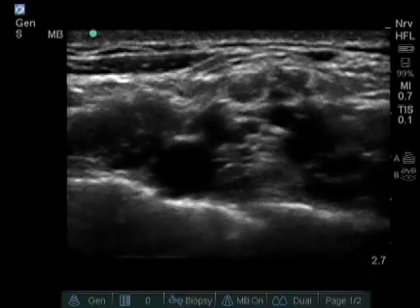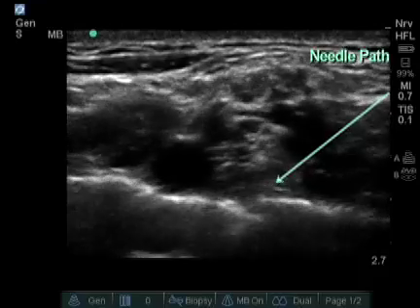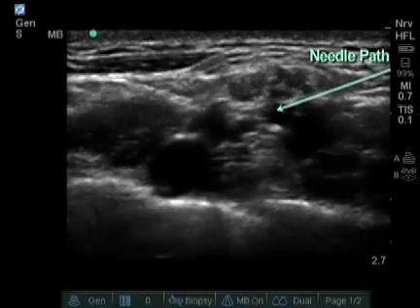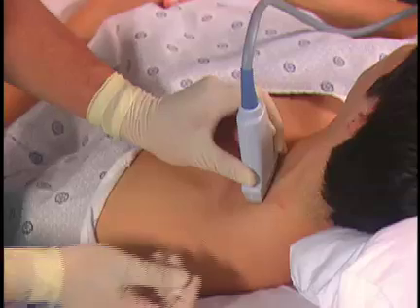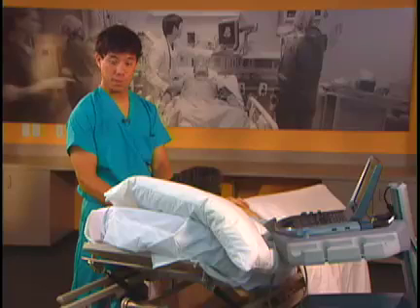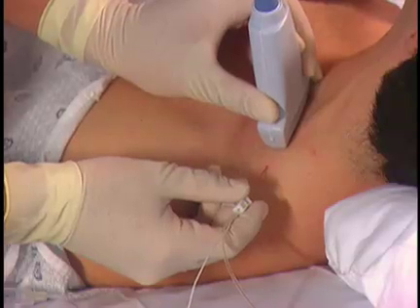Usually I do two injections for the supraclavicular block. I put one injection down in the corner between the pulsating artery and the first rib, and then a second injection up higher by the superior trunk. My needle position comes posterior to anterior and starts about a centimeter away from the probe. Starting a centimeter or more away from the probe keeps the needle angle flat and better visualized on the ultrasound machine.